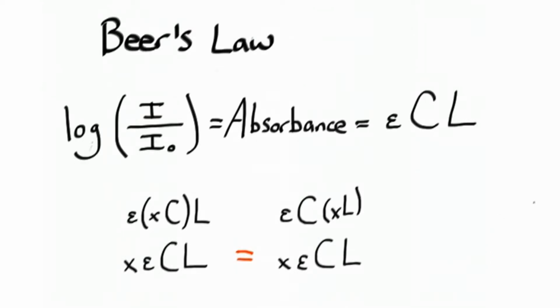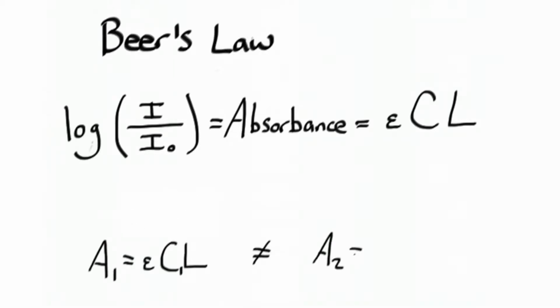In most applications, though, the path length is constant through the sample, and as long as that requirement of constant path length is satisfied, Beer's law is a powerful theory for determining concentration differences between samples. The difficulty with non-invasive glucose measurement is that the path length is not constant. Let's develop the concept of the path length histogram to really understand the problems of measuring glucose in tissue.